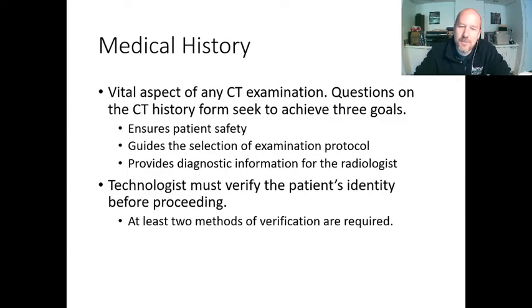All right. So once we've got the patient sat down in the exam room, that's generally the best place to get medical history, or somewhere close by the exam room. And we've got 3 goals in seeking this history. The first is to make sure the patient's going to be safe during the exam, particularly if we're using IV contrast, and make sure that the right exam is chosen. So in communicating with the radiologist, making sure that we're doing the right thing for the right diagnostic criteria.